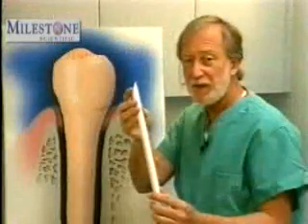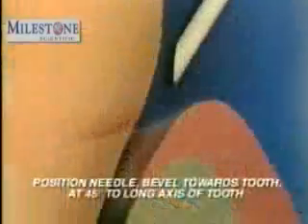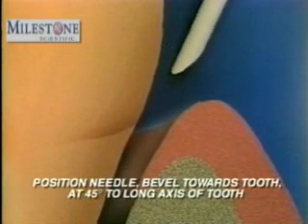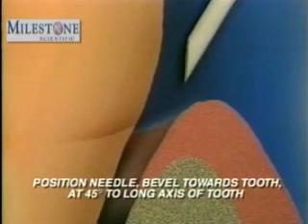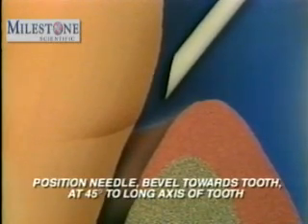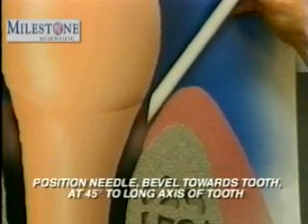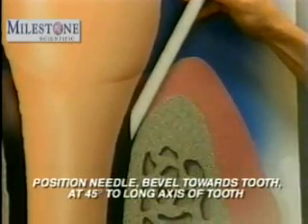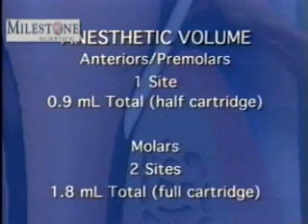Bevel orientation is very important to both the success of the PDL as well as patient comfort. The bevel must be facing towards the tooth, not towards the soft tissue. Initiating a slow flow rate, slowly insert the needle, sliding it down along the root as far as it'll go. When resistance is met, continue a slow flow rate of anesthetic and maintain pressure on the needle throughout the entire injection. Deliver 0.9 milliliters of anesthetic per injection site.